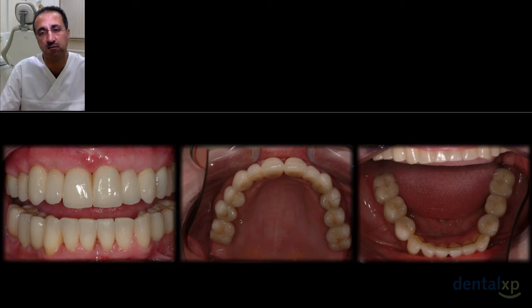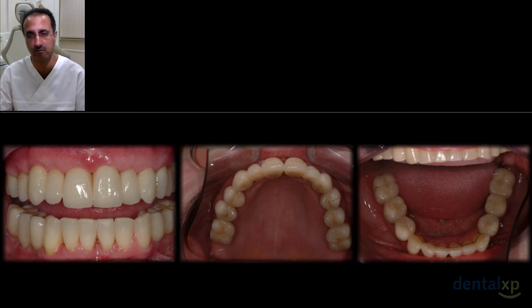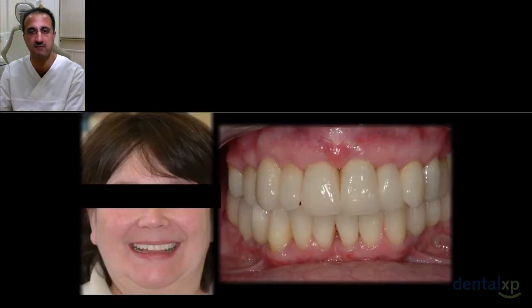In the end, I couldn't see any real good reason to remove it, and we kept this tooth, and you can see the restorations, the posterior mandible with single tooth crown screw retained restorations, and the maxilla with two single restorations, 3-unit bridges on the anterior and posterior, which are cemented onto the implants and abutments. So a combination of screw retained and cement retained as necessary according to the position and angulation of the implants. This is how it looks.